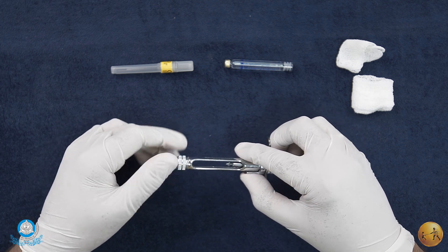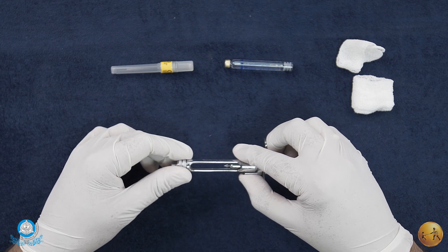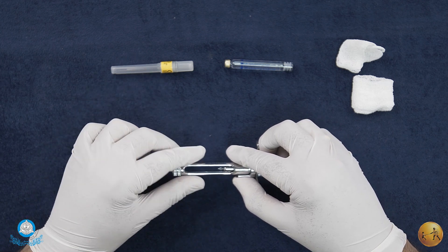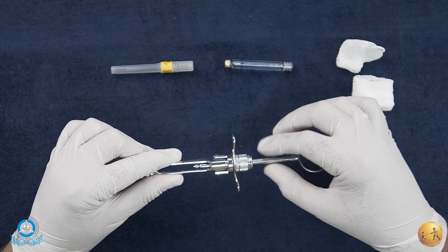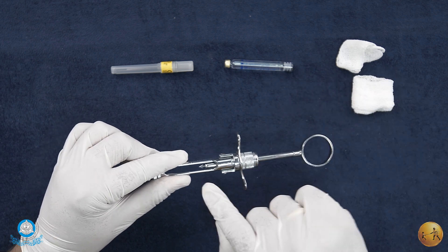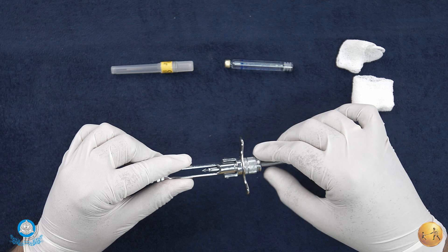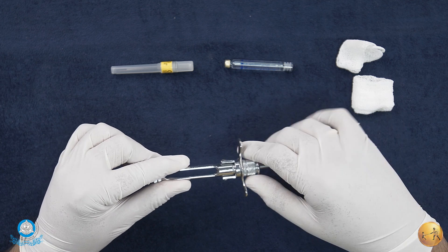We'll show you when we assemble the actual syringe itself. Now here you see the plunger with the thumb ring and a harpoon in between.